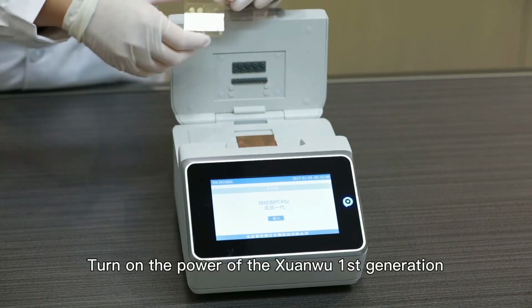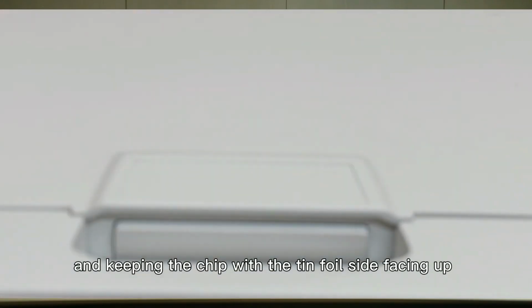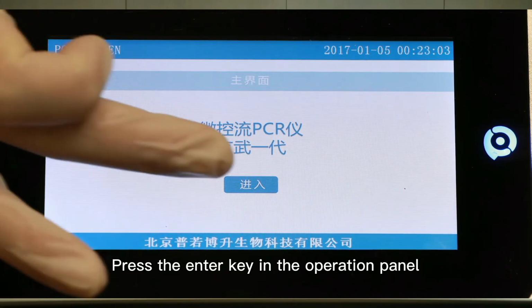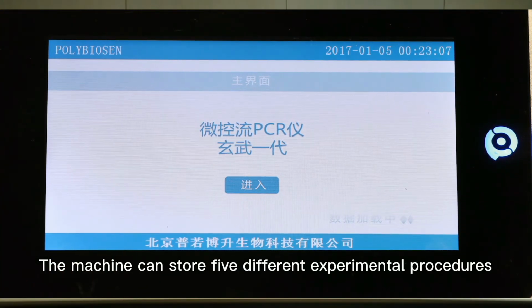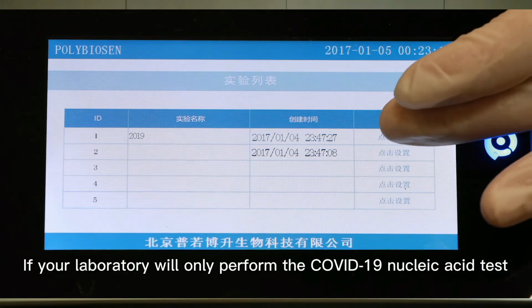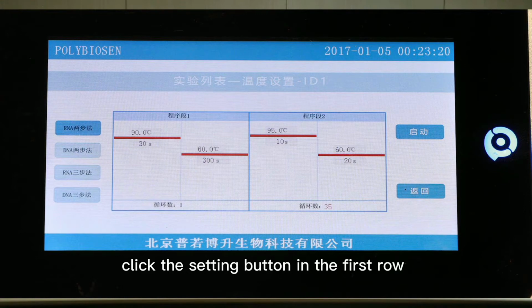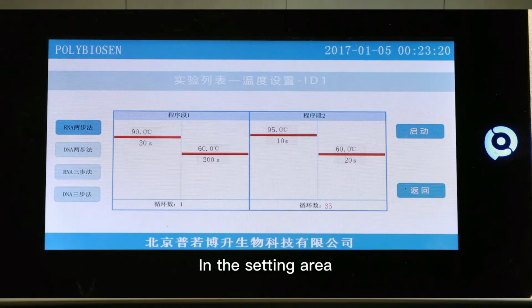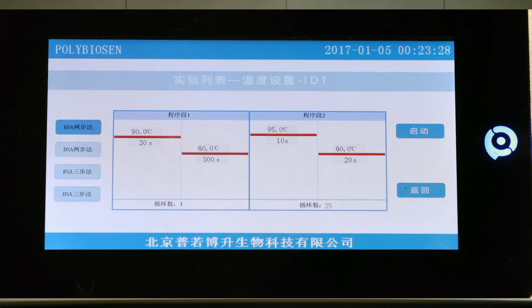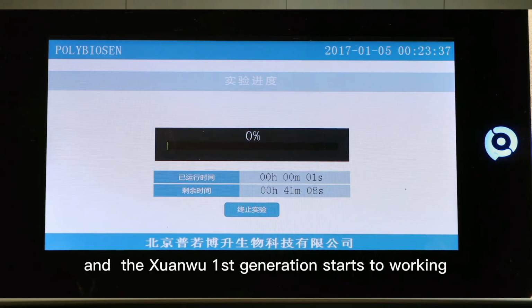Turn on the power of Xuanwu first generation, open the upper cover, and snap the chip into the slot with the tin foil side facing up, and close the upper cover. Press the Enter key in the operation panel. The machine can store 5 different experimental procedures, and the name can be edited independently. If your laboratory will only perform the COVID-19 nucleic acid test, click the Setting button in the first row to enter the experiment directly. In the setting interface, confirm that the program on the left side is RNA two-step method. Click Start, and the Xuanwu first generation will start working.